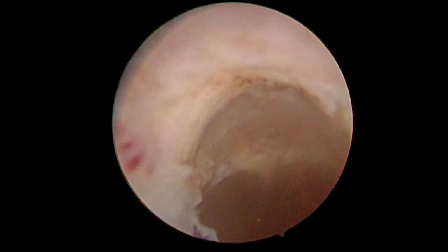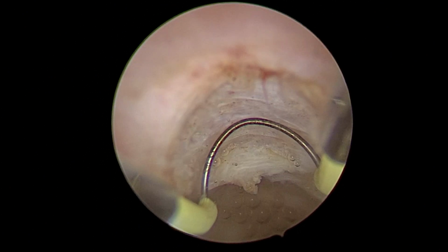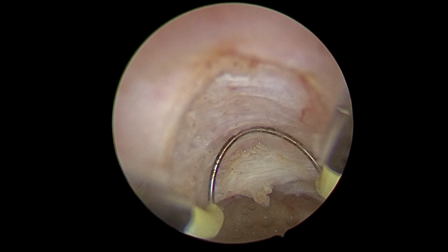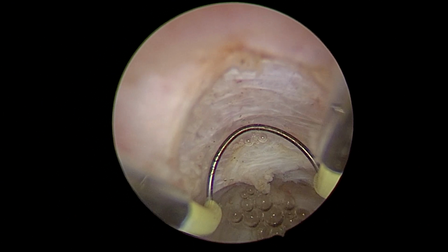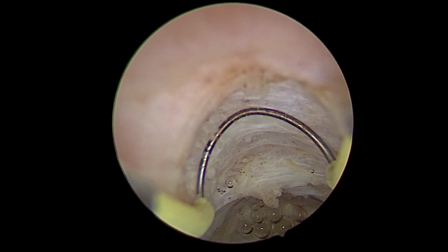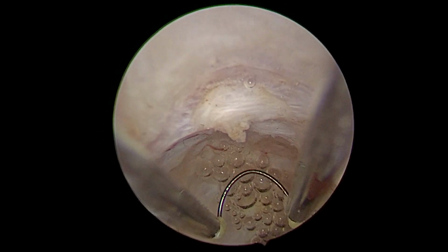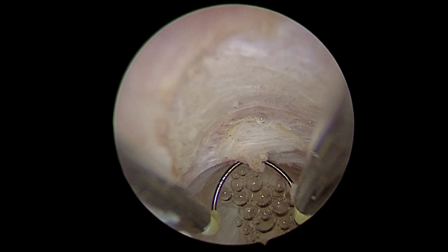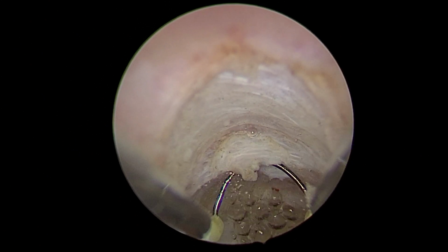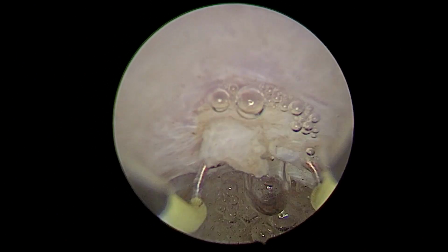Now here there is a very small bleeder which came at the time of resection. So with the help of the resectoscope, we can do point coagulation of the bleeders. Here you go very slow, identify the bleeder, use coagulation current and burn the bleeder. So bleeders can be taken care of with the resectoscope using coagulation current.